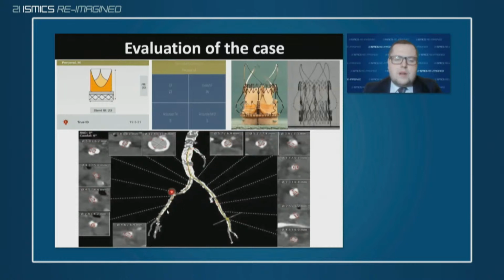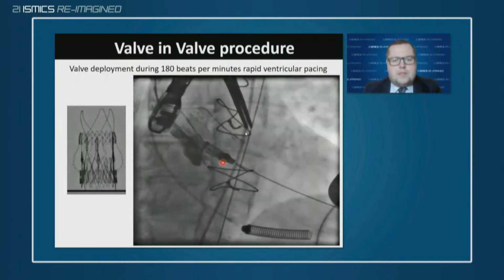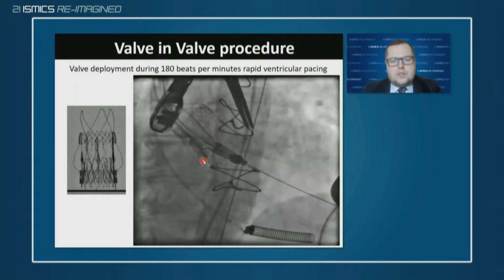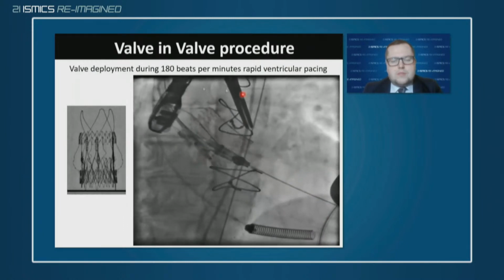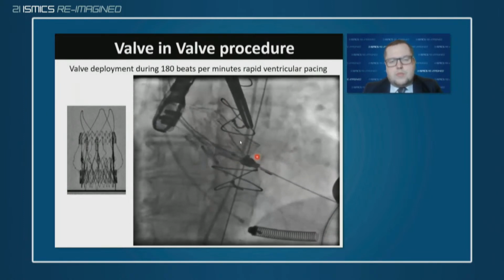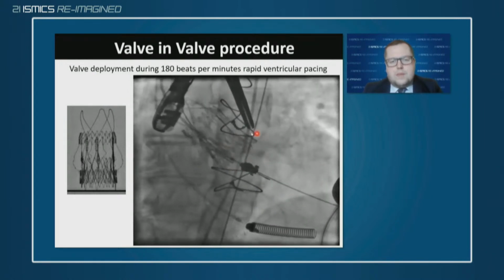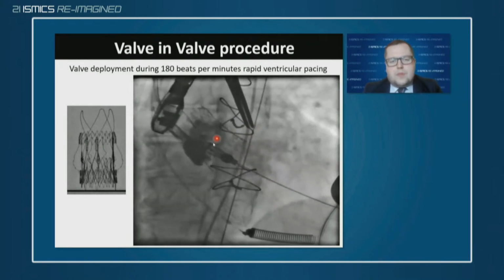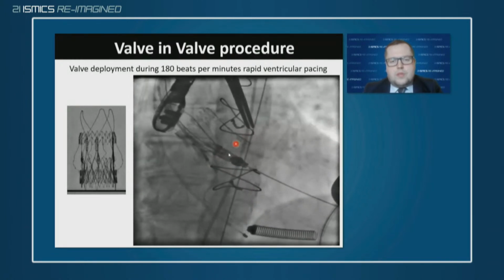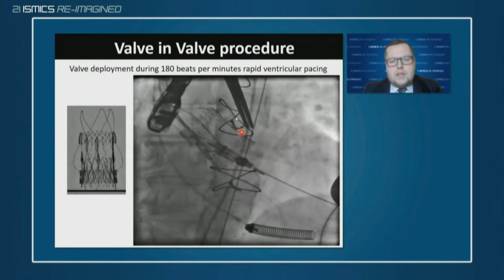Due to the severely calcified femoral arteries, we abandoned the transfemoral approach for the transapical approach. After performing the transapical approach, we put a 6 French pigtail into the non-coronary sinus, made the implant view check, and then put the delivery system through the apex to the aortic valve plane. The ACURATE neo valve black marker should be put in the inflow ring of the Perceval S prosthesis.